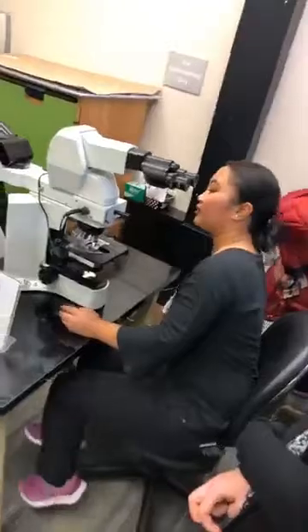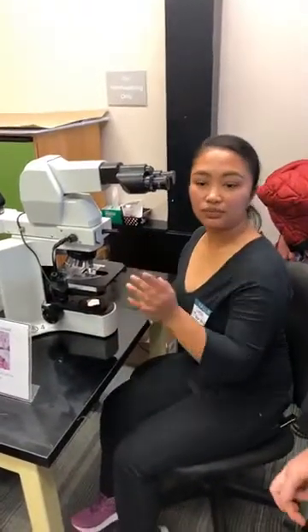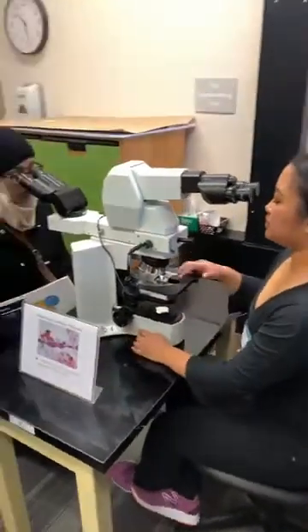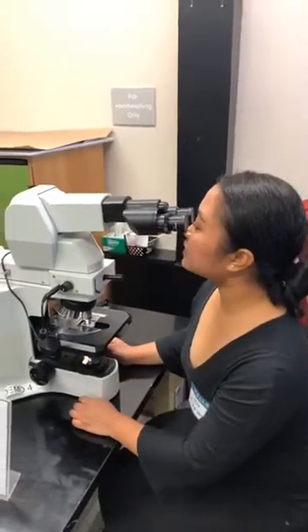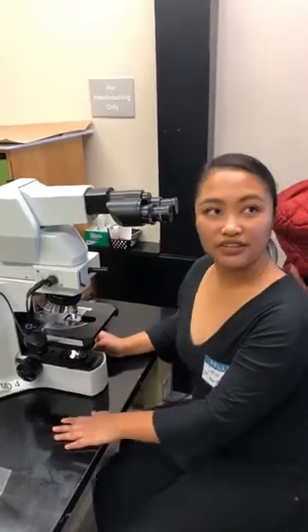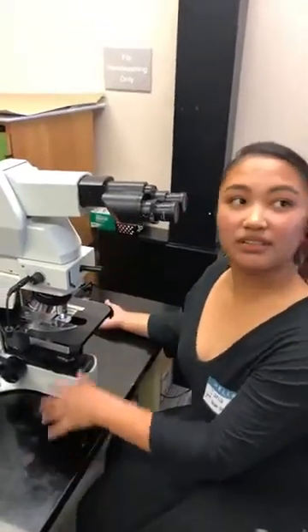What are you guys looking at? We're just looking at a slide, which is a double-headed review, where my professors and I look at it one-on-one after we've screened the slide individually on a microscope. We mark the cells we're interested in, and then we diagnose them and say what we feel the cells are. We look at the chromatin pattern and the nucleus, and we look at our criteria, which we use to diagnose whether it's a normal cell or an abnormal cell.